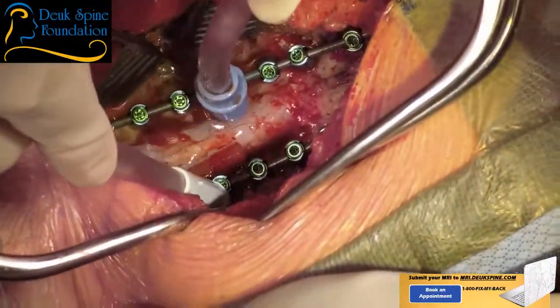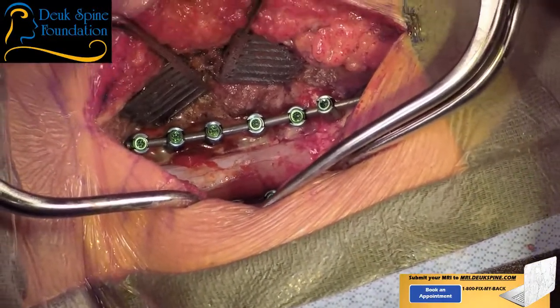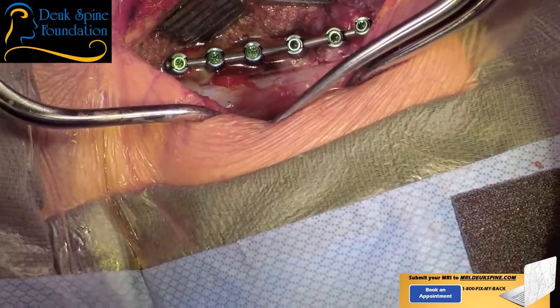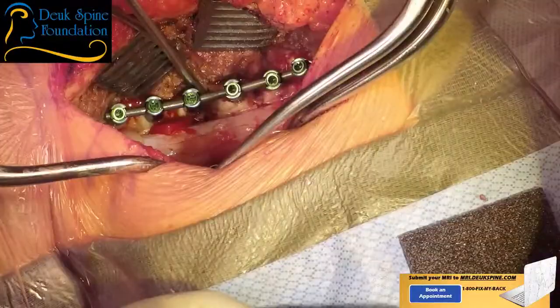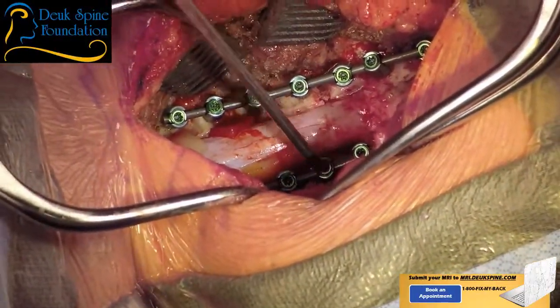So, I'm going to decorticate. Let's see. Go ahead and put your suckers back on. Can you guys see okay through my view? Yes, we can. So we're going to decorticate, and then we'll go ahead and put in the graft. Where's my drill? There we go. You got it? Yep. All right. Let me have you hold this for a moment.